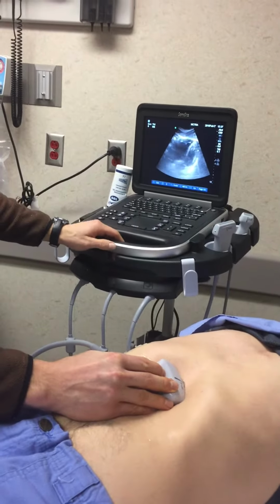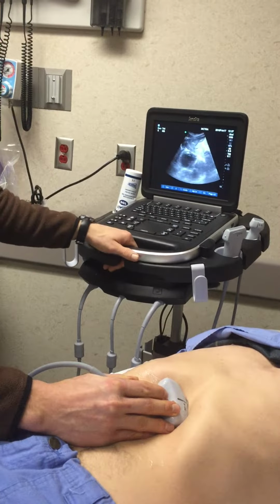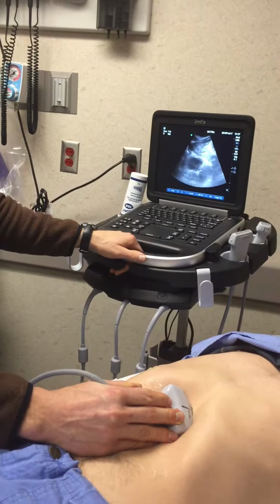You can take a breath. If you can't see the fluid on that view, you can adjust into a different cardiac view, such as a parasternal long or apical view, to help with that.